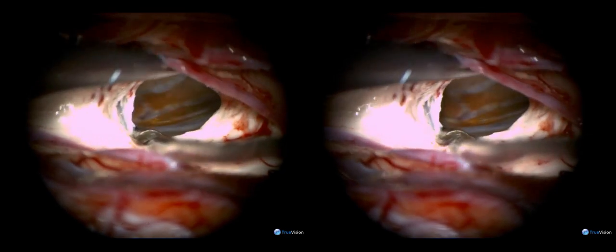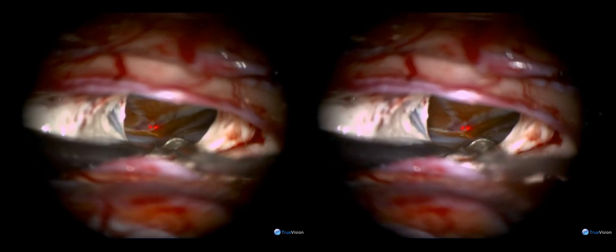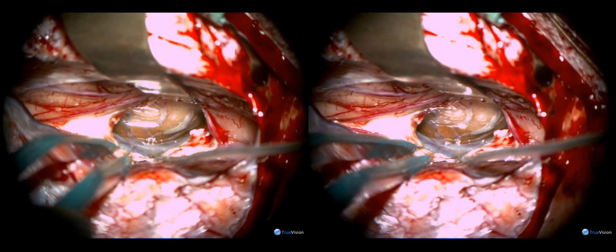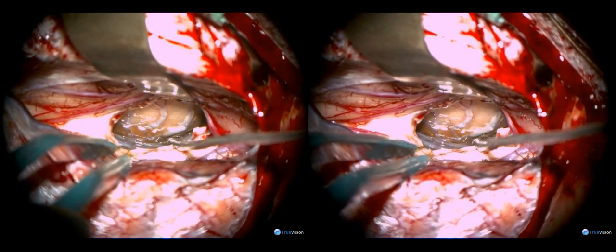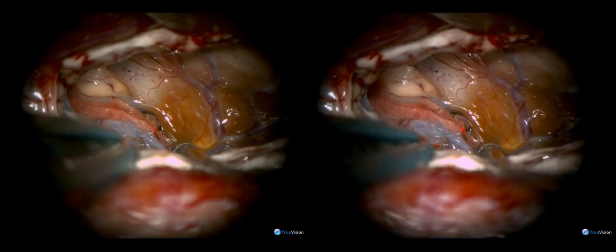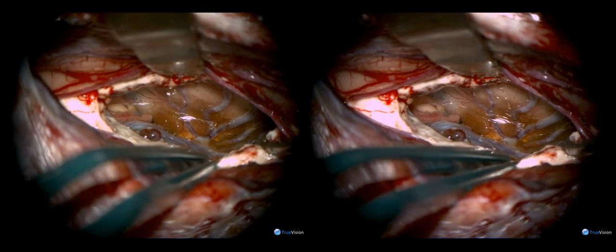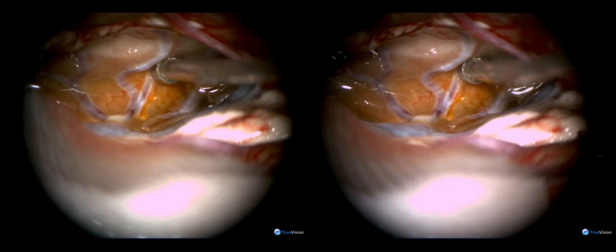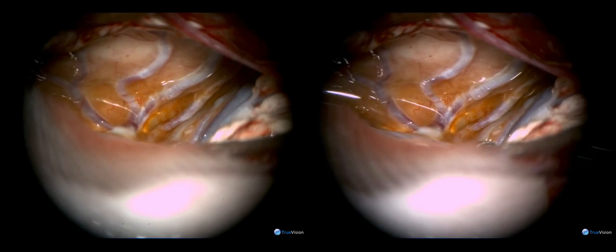This is the contralateral trajectory which visualizes the lateral wall of the left ventricle. You can see the foramen of Monro and its choroid plexus there. You can also see the venous malformation overlying the lateral wall. There is hemosiderin staining which indicates the underlying location of the cavernous malformation.